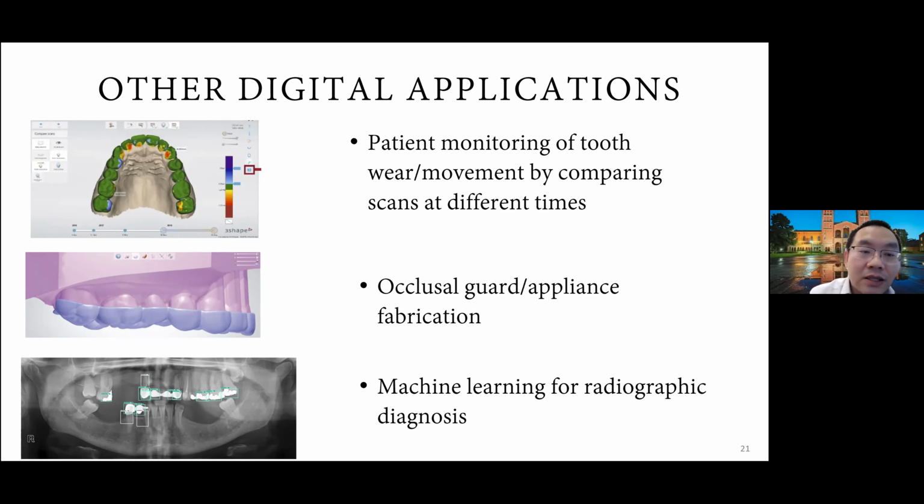I know he is going to be a bruxer. I would then be able to compare how the teeth have changed over time. Pick any 2 timelines, compare scans, and be able to see if there's any part that is worn down more than usual. That could be a restoration or a tooth, but that's a really good visual tool for your patient. It's time for the night guard.